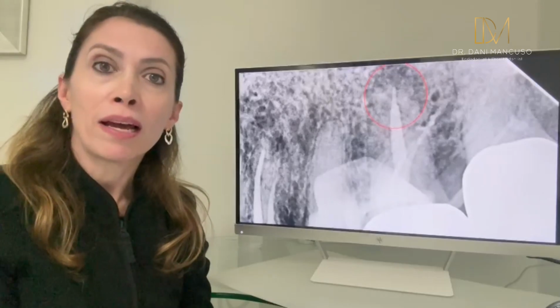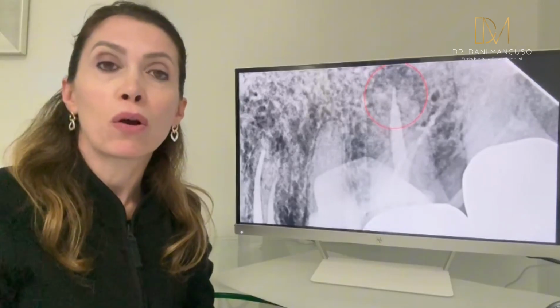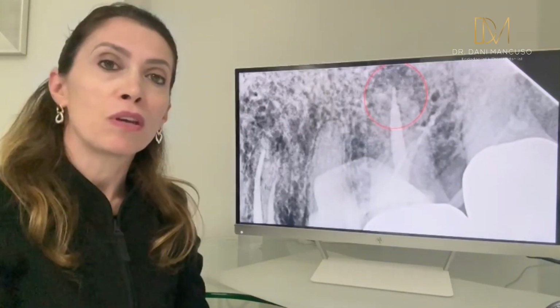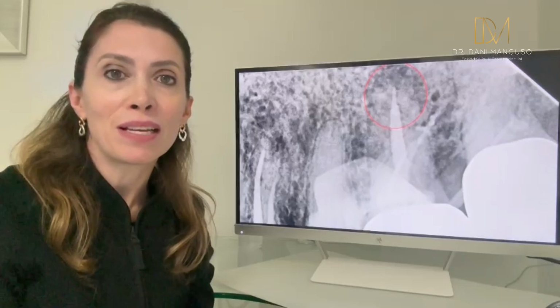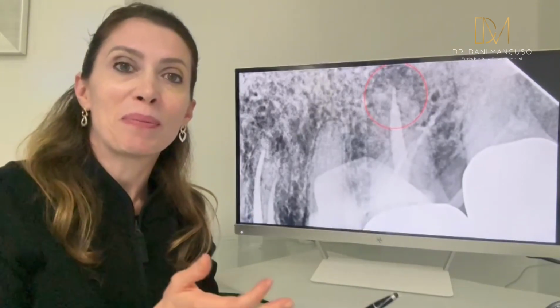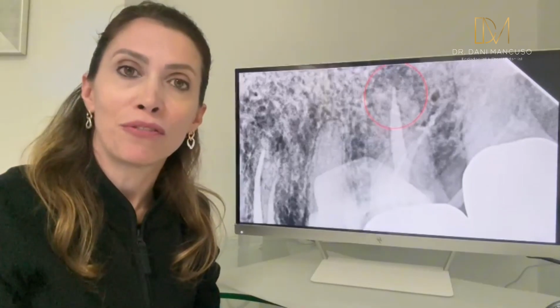Instead of that, I like this x-ray when we take the x-ray with a cone fit with the sealer already in there, because at that stage I can fix everything I want. If I close that tooth, then I need another appointment to remove the GP and to fix the problem.